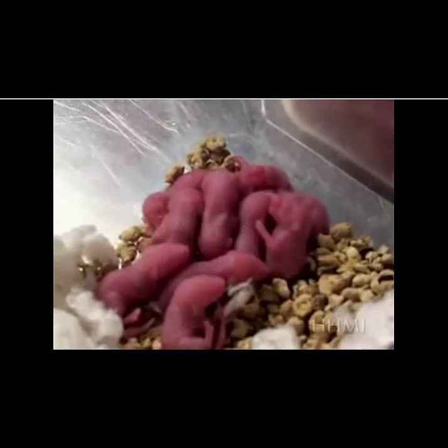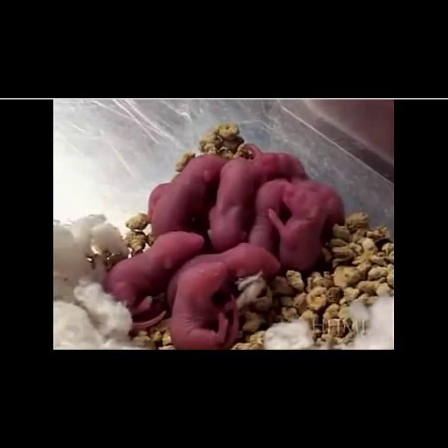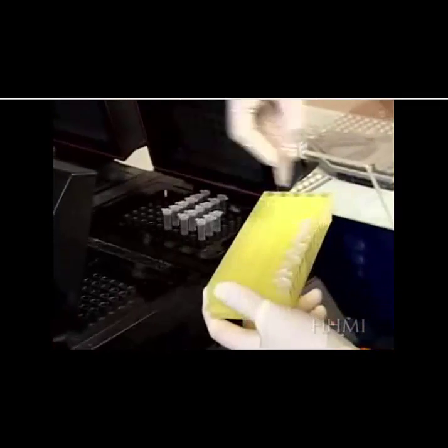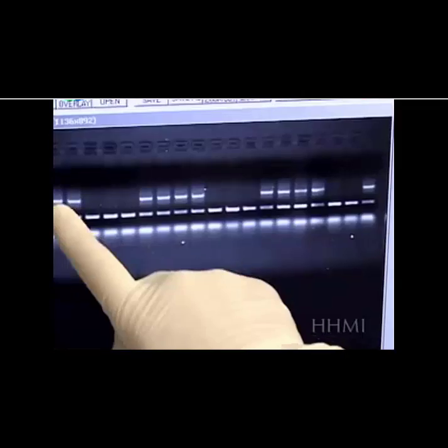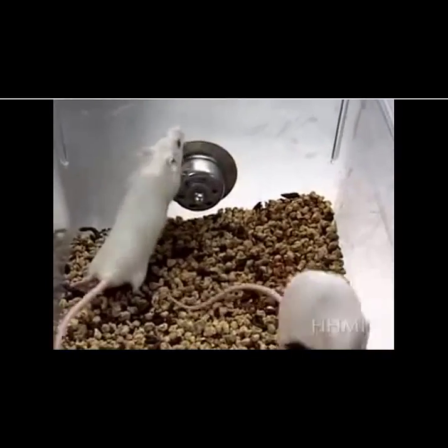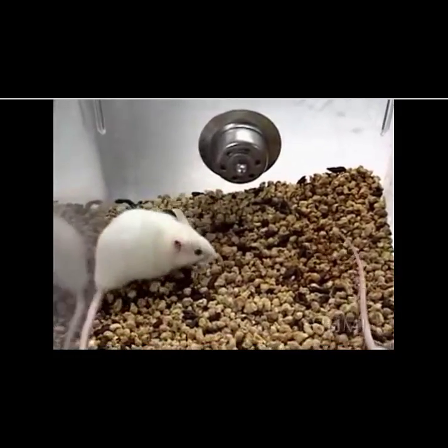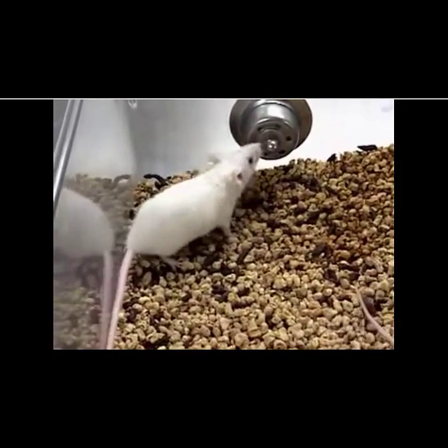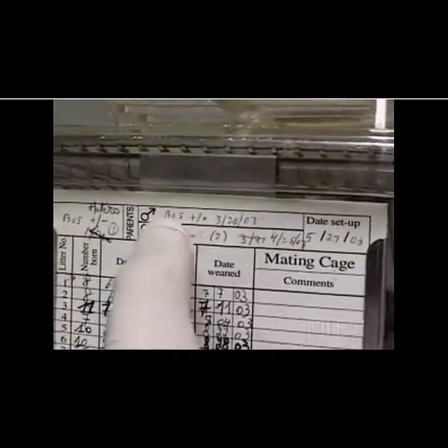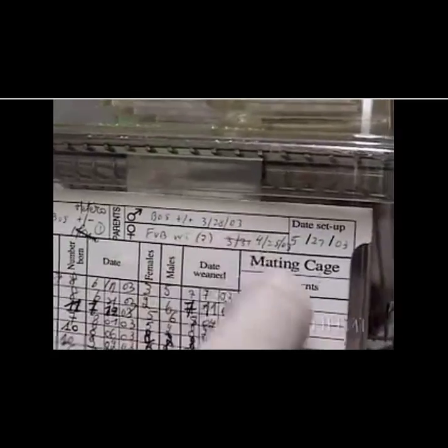Not all pups may have successfully incorporated the transgene. To test which pups have the transgene, a small sample is taken from the tail and analyzed by PCR and gel electrophoresis. Mice that have the transgene are bred with wild-type mice. The offspring are again tested for the presence of the transgene. It is important to check that the transgene can be stably transmitted to the next generation in order to establish a line of mice that carry the new gene.